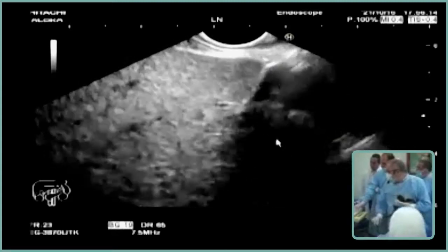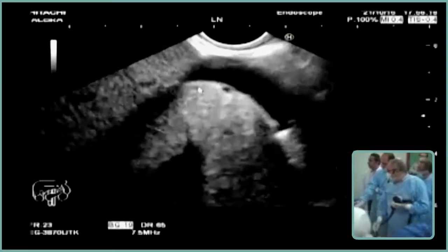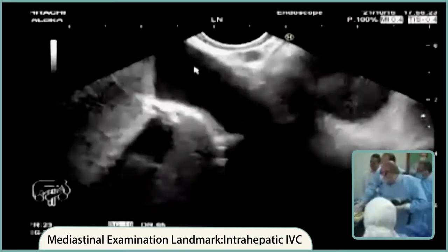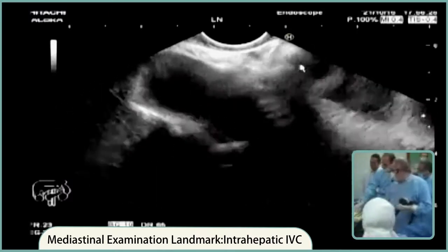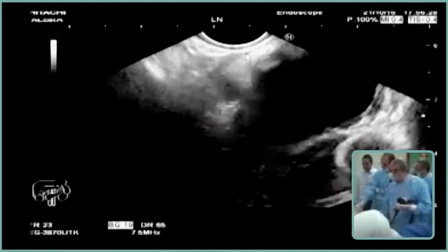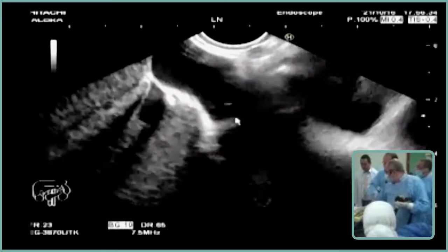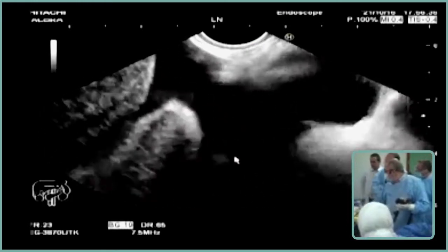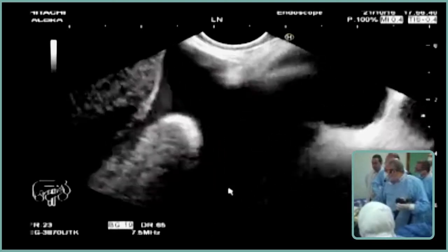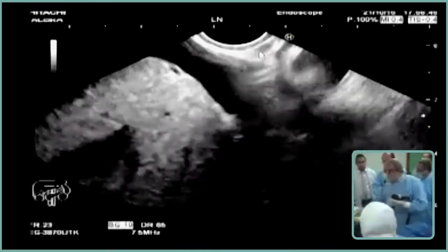We are going to the chest now. We start from the IVC — anticlockwise to see the right atrium. Between the IVC and the right atrium, this is the left atrium and this is the right atrium. This is the IVC going to the right atrium, and this is the Eustachian valve between the IVC and the right atrium. Here is segment 9 — there is a small lymph node in segment 9.